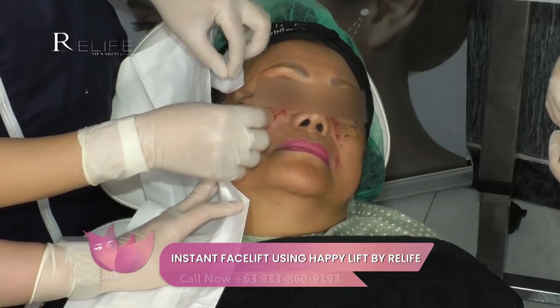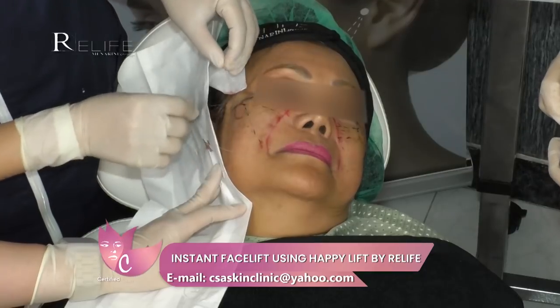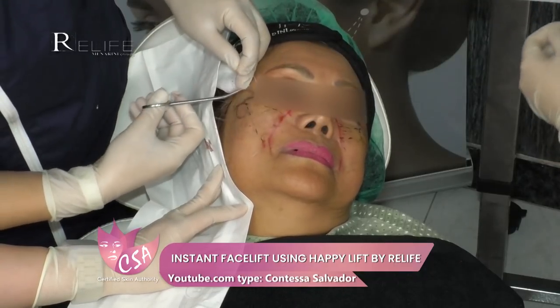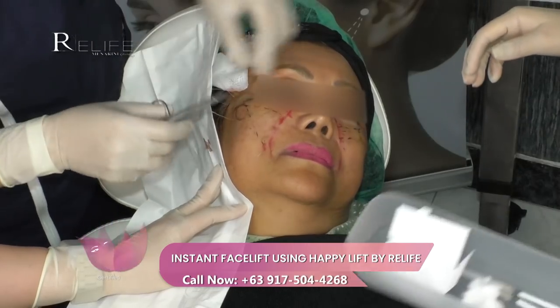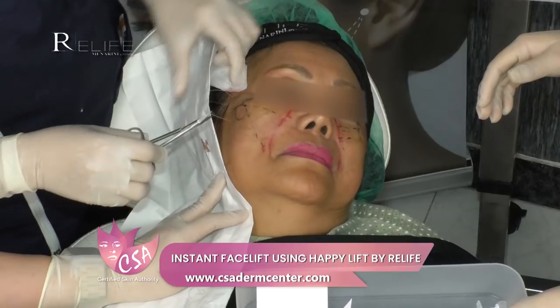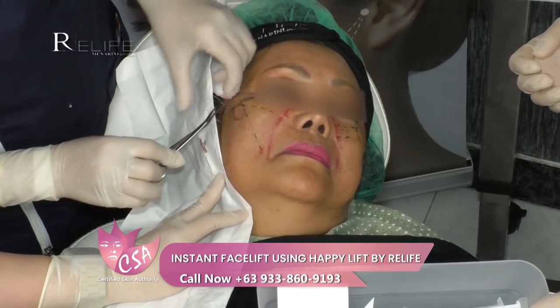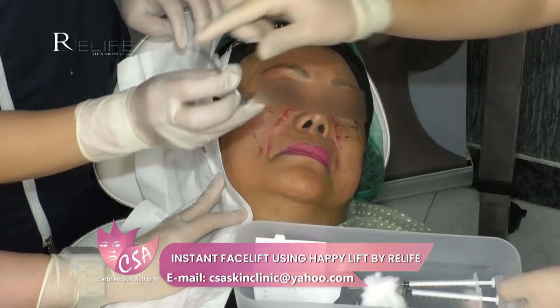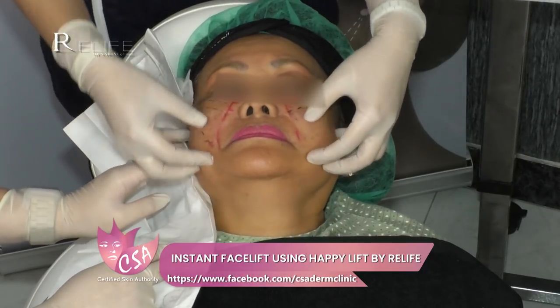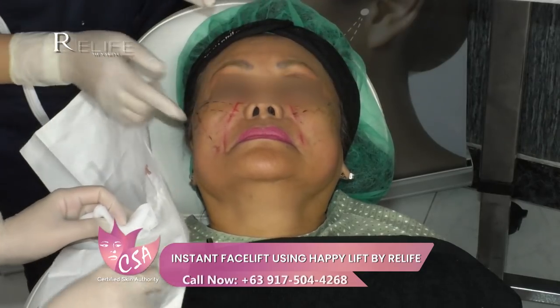For doctors, it's very important to be knowledgeable about face anatomy — you have to master the anatomy of the face, the different blood vessels, arteries, veins, and nerves, as well as the different soft tissue layers. This is an advanced technique that requires significant training. Pressing and lifting gently now — there's already a bite of the cog in the inner tissues of the face. I can already appreciate a lifting. The nasolabial fold has been decreased, the mid-face part has been repositioned, and the fat compartments have been lifted.